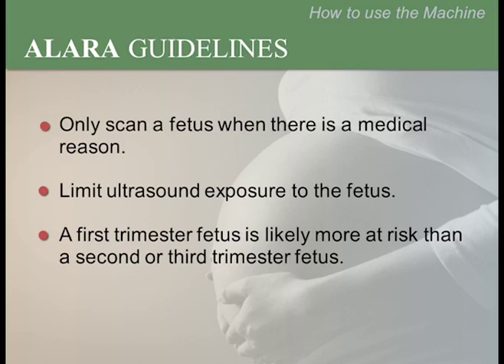The ALARA principle states that we should scan a fetus only when there is a medical reason, and that we limit the ultrasound exposure during those scans. We can limit exposure by decreasing the output of the ultrasound machine and decreasing the time spent scanning. We will review this in the hands-on sessions. Excessive exposure can heat the tissues. In theory, a first trimester fetus would more likely be affected from heat than a second or third trimester fetus.